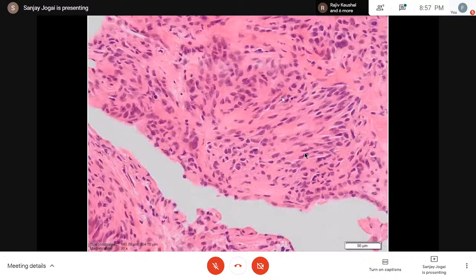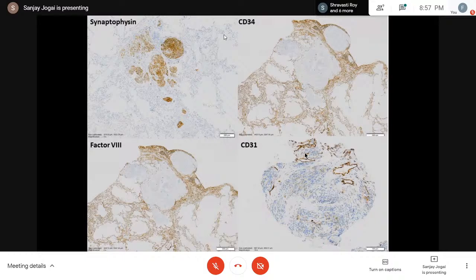Sclerosis, spindly, what is it? And sometimes you get involved in cases and you are scratching your head, you have asked people, still not getting a diagnosis. Clearly, it is not a carcinoma. The morphology is not of a carcinoma. So, I did the whole panel again.